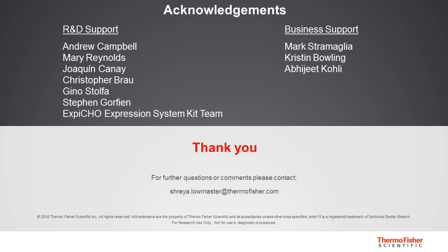And do you have any specific vector recommendations other than pcDNA 3.3 and 3.4? Yes, Cytovance has done work with a different vector, so there are multiple vectors that are viable with this system. And what media, in reference to the question above about how many wells survived, in what media? At that point, you should be using the ExpiCHO expression medium for that stage.